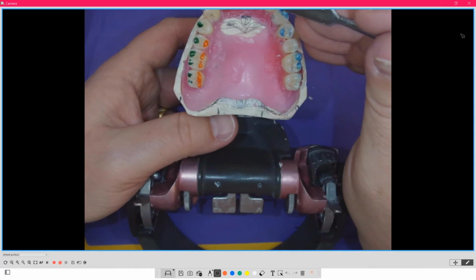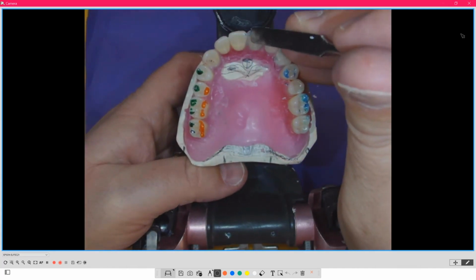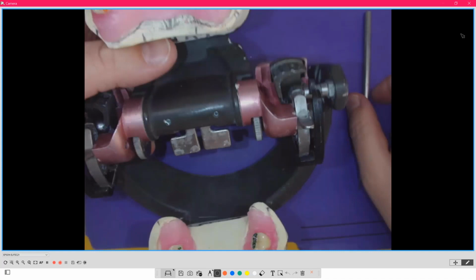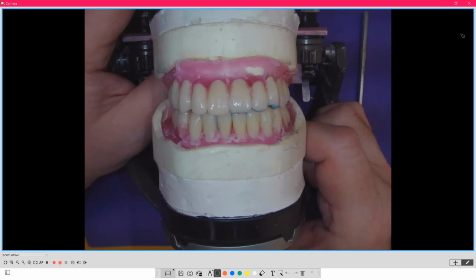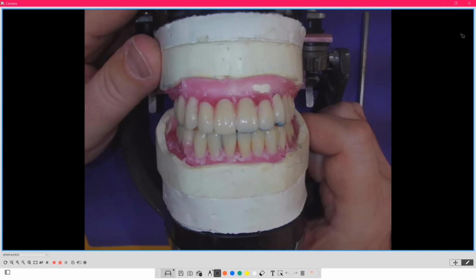And then I would also check the anterior, usually with blue, to go in and check for that in the mouth on a wax try-in. Days of the week, months of the year. And then that allows me to provide somebody with a more in-tune denture to their specific chew cycle, i.e. their fingerprint, their retinal scan.